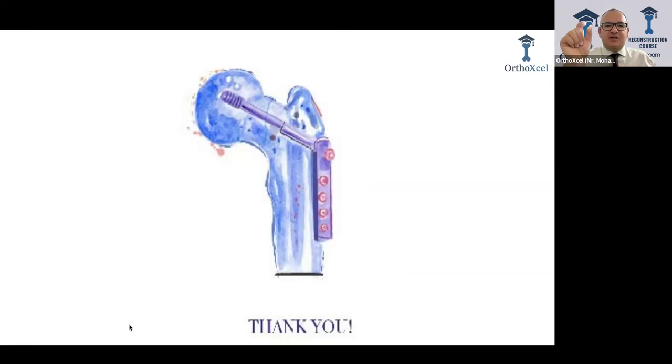So even with the adjustment, so if I put like +4 adjustment on an Exeter stem, yes, it mainly increases the offset. It affects the length very, very minimally, but it still affects the length. So theoretically, yes, you can do. So with an adjustment, I can increase the offset.